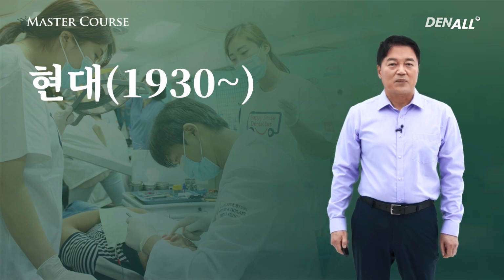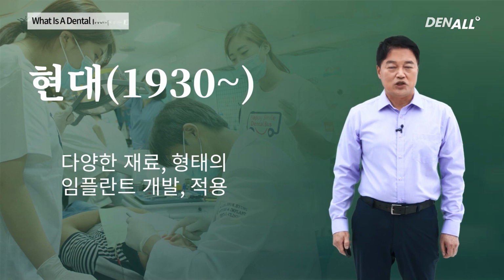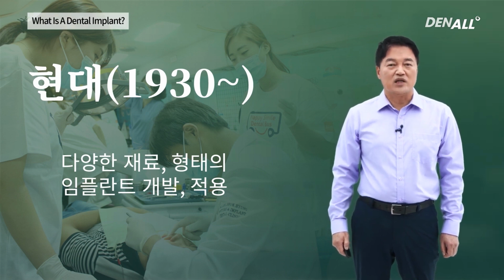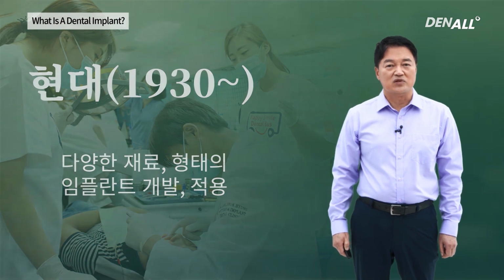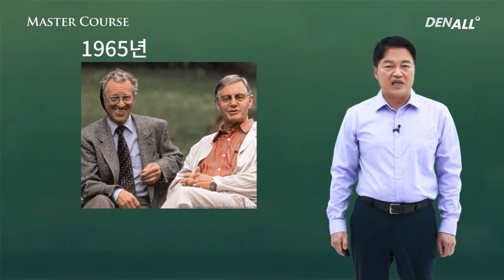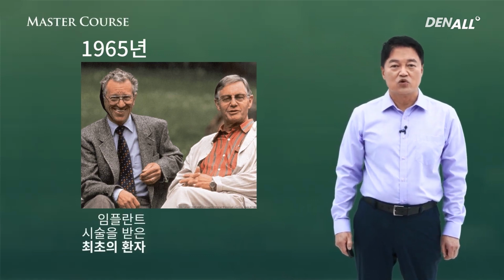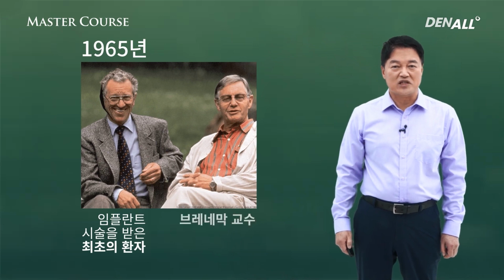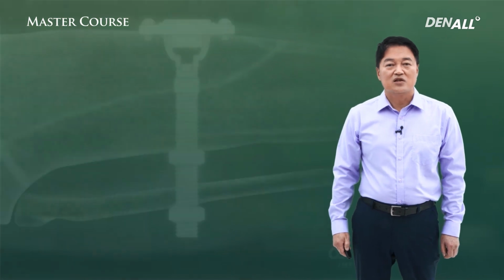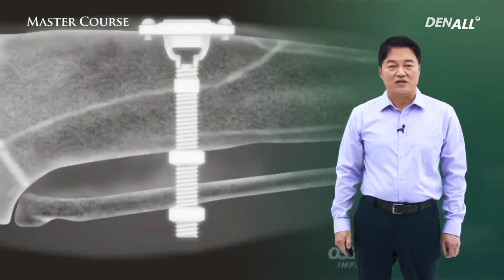Modern day implant. Let's look at history. It started from 1930s. Multiple materials and shapes of implants were used and developed. The most important modern-day implant concept was first established by Brånemark in 1965. On the left is the patient who received surgery for the first time, and on the right is Professor Brånemark. Osseointegrated implant was first started by Professor Brånemark.